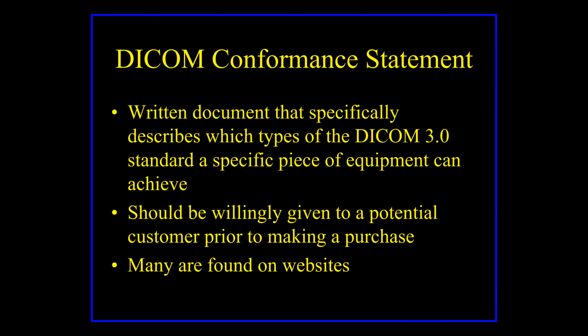And most of these systems will come with what's called a DICOM conformance statement. It's actually a piece of paper that will tell you that here's the specifics that we have tested this, and we will guarantee it will work. Okay. Some of the cheaper systems will not have a DICOM conformance statement because they haven't tested it, because they know it's not going to work.